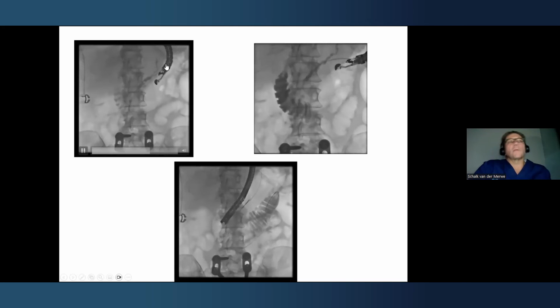And this, I think, is very important, because if you look at the studies where surgery was superior to endoscopic therapy in patients with chronic pancreatitis, in those studies, endoscopic management failed in up to 62% of patients. So in 62% of patients, endoscopic access to the pancreatic duct via the retrograde route was not possible. But now with EUS, we should be able to overcome this.